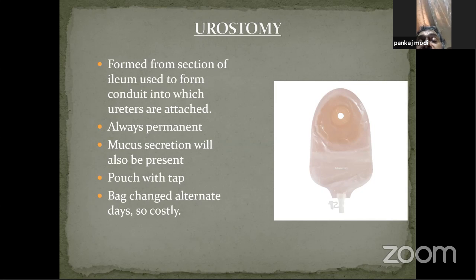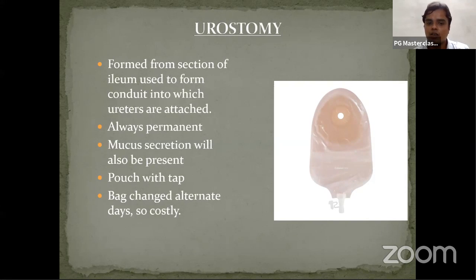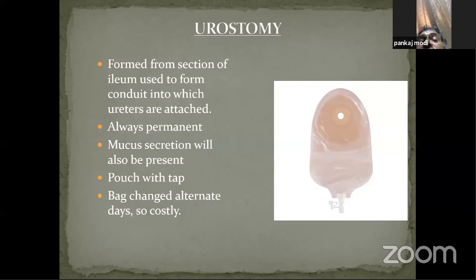So one difference Apurva has mentioned. What other difference is there from the ileostomy? Sir, the measurement is very important. Do you understand? Urine output measurement is very important because it has its own complications. So ideally, if you see a urostomy bag nowadays, it has markings showing 500 ml, 100 ml, like that, because you have to measure. When you normally apply a stoma or ileostomy, there is no need to measure exactly how much output there is. What we are concerned about is whether it is functioning or not. Do you understand? Yes, sir.